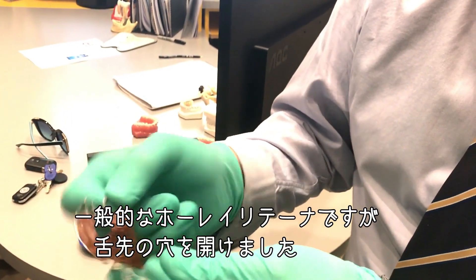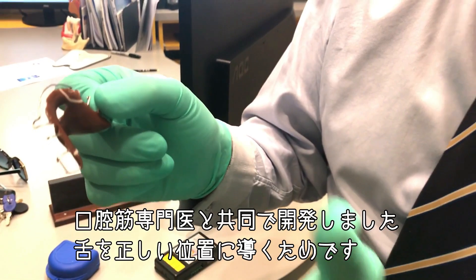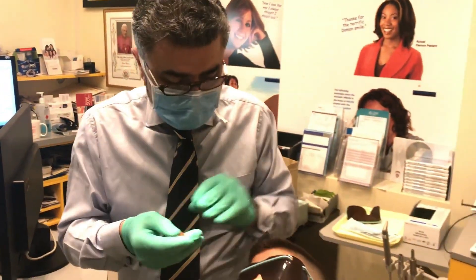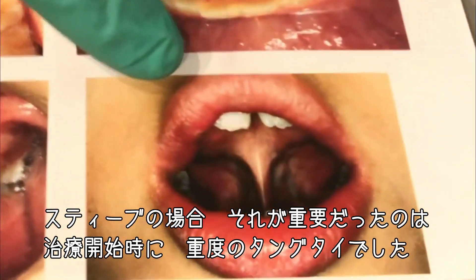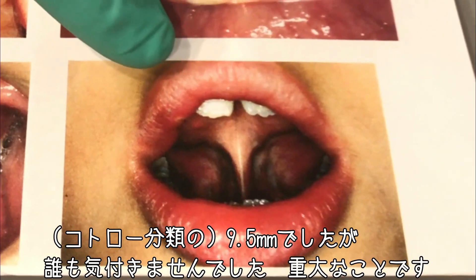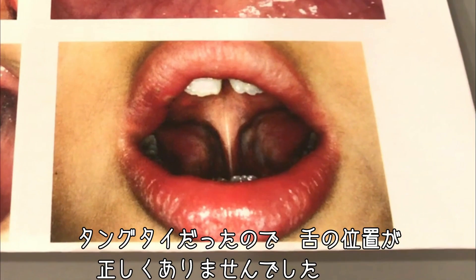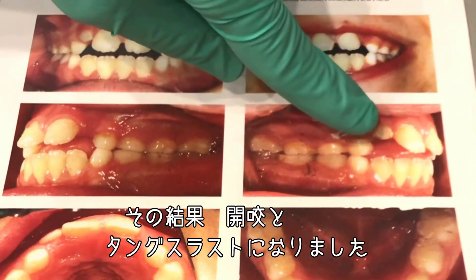It's like a standard Hawley, but I put a hole in the spot and then we work with our oral myologist so that the tongue can go in the right position. Now that's important in Steve's case because when Steve started, he was extremely tongue-tied and no one had picked that up, even though he was like nine and a half. Because he was tongue-tied, the tongue was sitting in the wrong position, causing this open bite and you can see the tongue thrust.